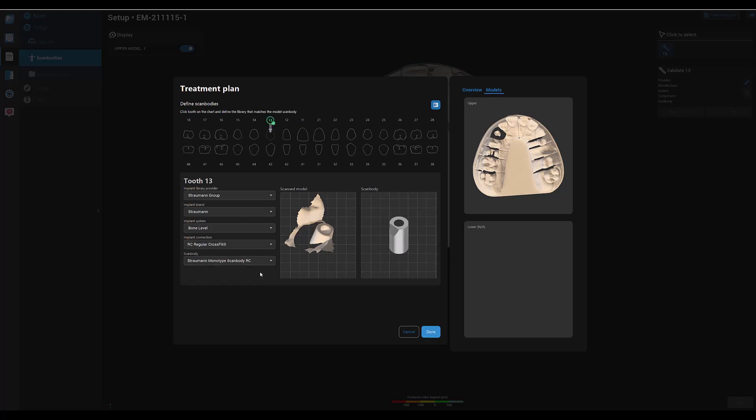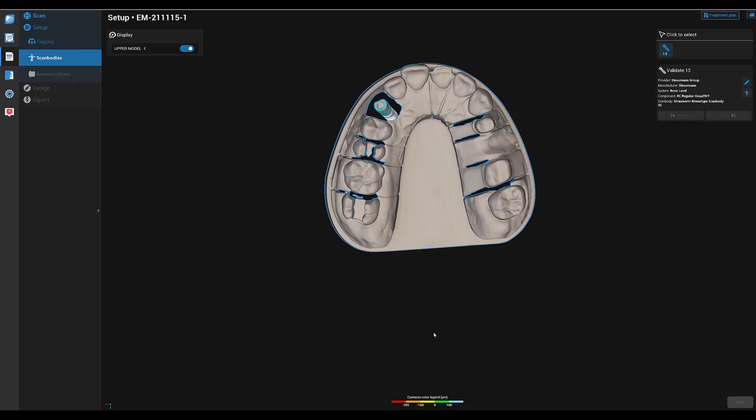The scan body is also shown in the preview window. In case you selected the right scan body, you get a green dot to confirm.